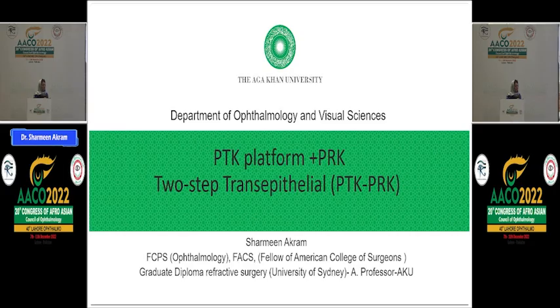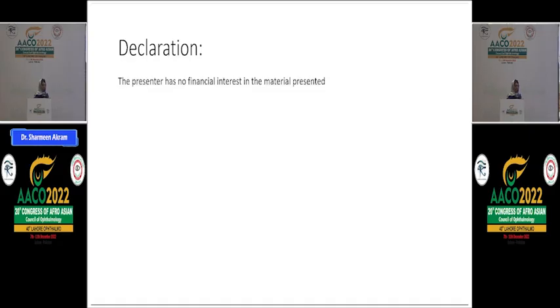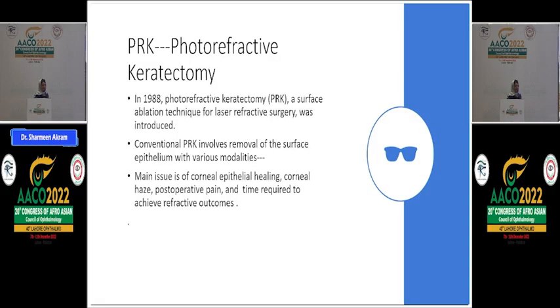First of all, thank you for providing me this platform to give my presentation. This is on the PTK platform for PRK, which many of us are doing. It's just more detailed than what we do at our center. That's my declaration slide. So, photorefractive keratectomy: most of us here are probably doing refractive surgery, and are aware that PRK is one of the laser-based techniques of surface ablation to correct refractive errors.